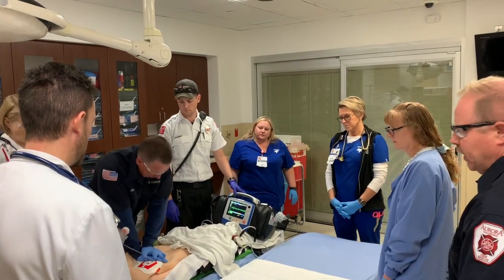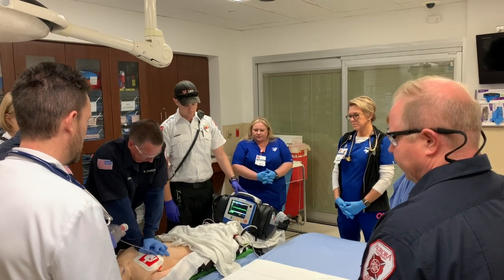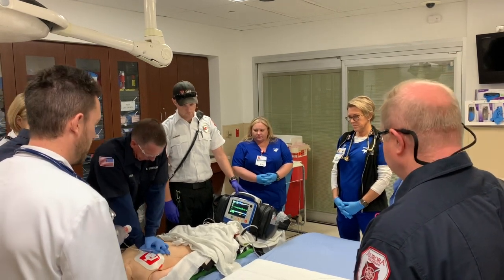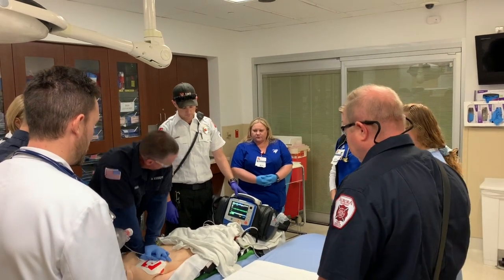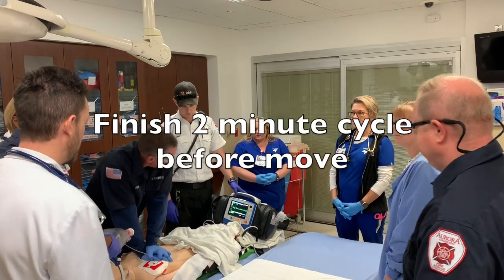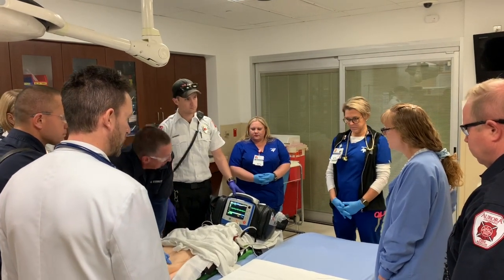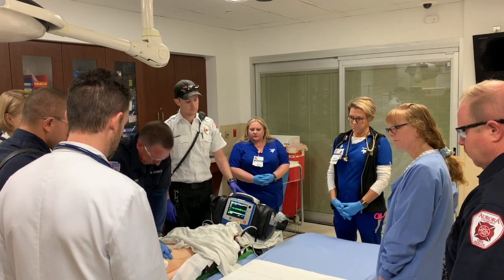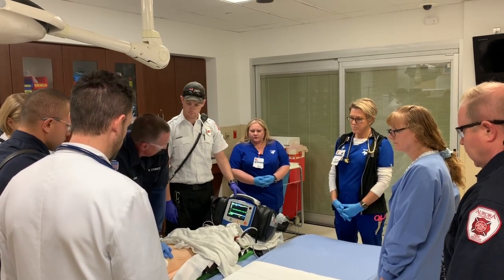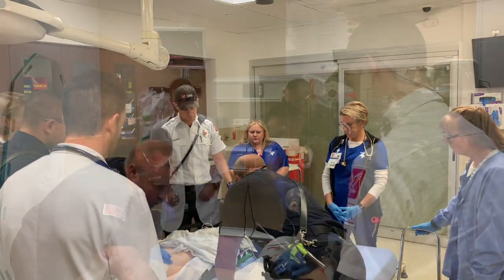We've shocked him a total of 9 times. He's gotten 3 rounds of epi and a total of 450 of amiodarone. We got him intubated with an 8.0 at 24 at the teeth, and end-tidal CO2 has been in the mid-30s, and an IO on the left leg. We'll finish our 2 minutes of CPR, and then once we... Minute 45. Monitor.